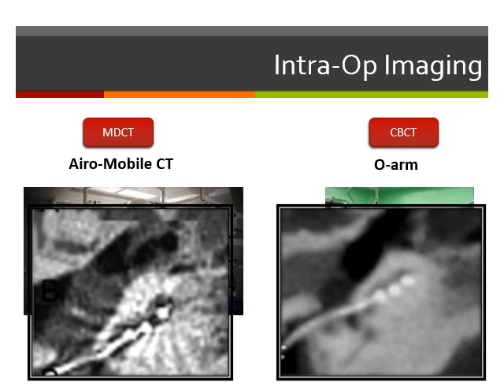However, the main disadvantage of the cone beam CT in relation to the multi-detector CT, which is usually not intraoperative, if we do it pre-operative or post-operative, is that the cone beam CT requires the head to remain still or fixed for a longer time than the multi-detector CT. This can be difficult for a child, because the child has to sit down, not lie on a table, and not move his head until the whole testing ends. This could be somewhat difficult for children.